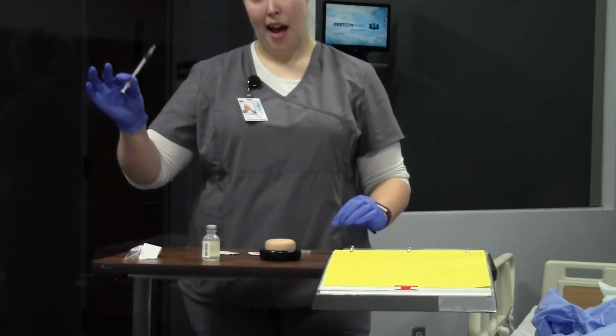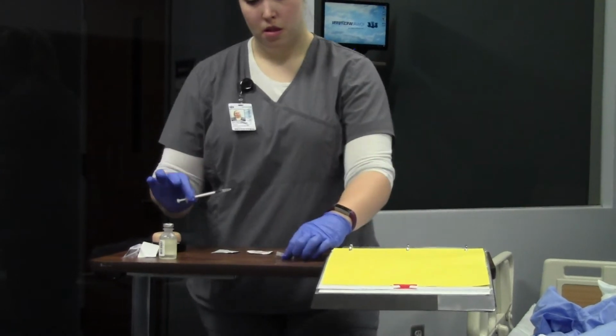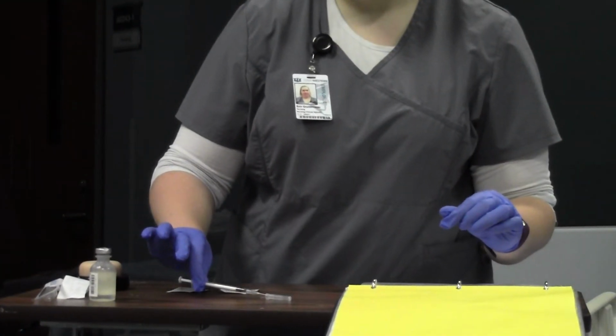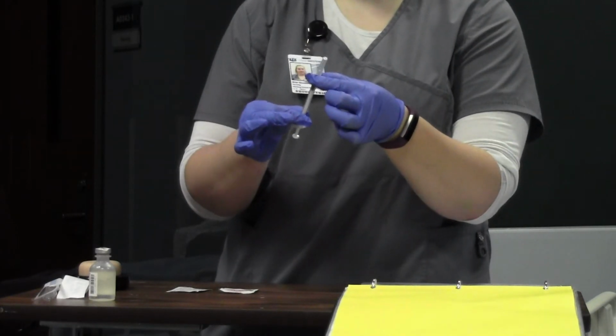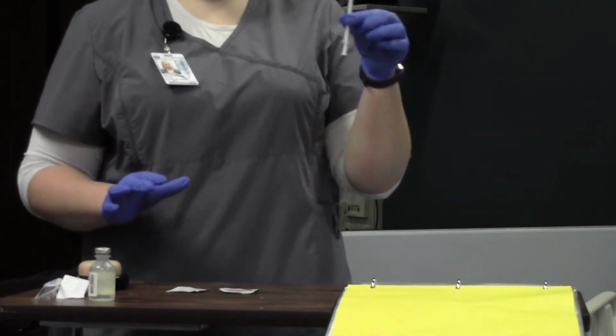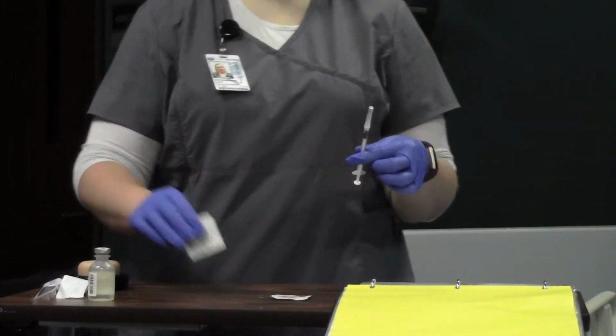And in order to recap, when you recap your needles, you're going to just scoop and then click. I'm going to make sure that this is still tight and everything. And then I'm going to take my medication to my patient and perform the administration.